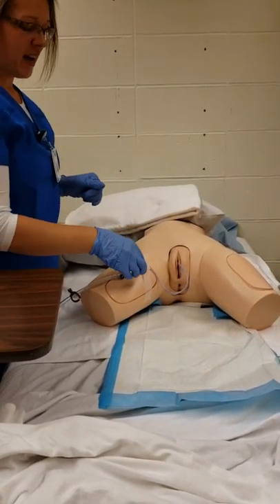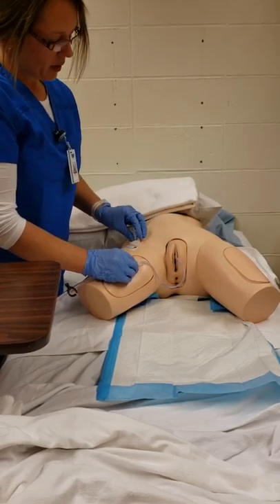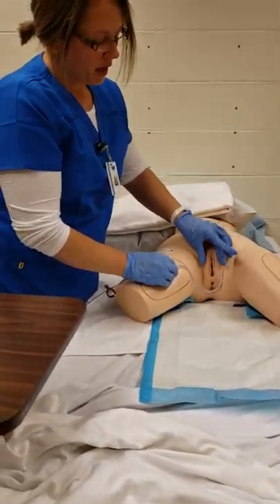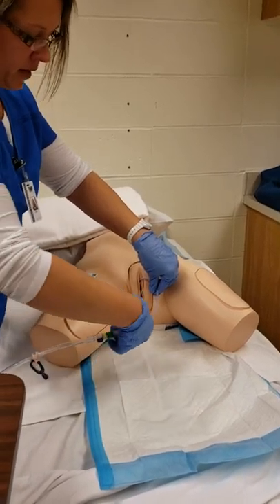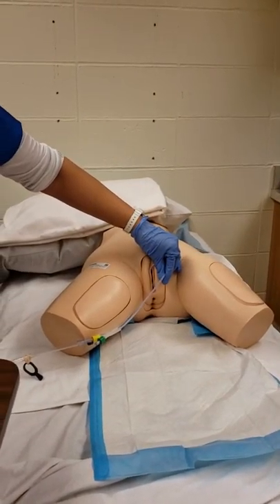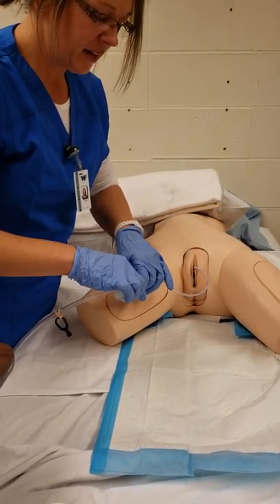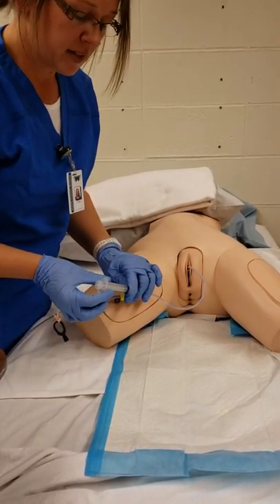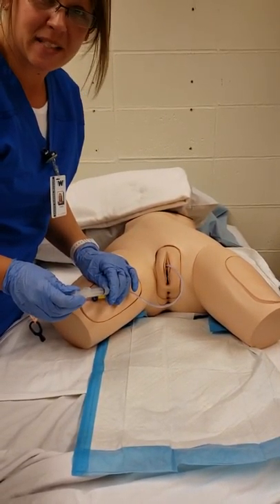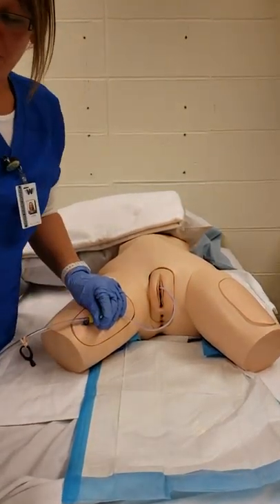I go to my patient, grab the catheter balloon port, and remove the connection to the drainage bag, making sure to stabilize. I insert a syringe into the inflation port to withdraw all 10 mL of saline from the balloon. Since it didn't work on this mannequin, I verbalize that in practice it would release up to 10 mL, deflating the balloon before I remove the catheter. That syringe is then disposed of.